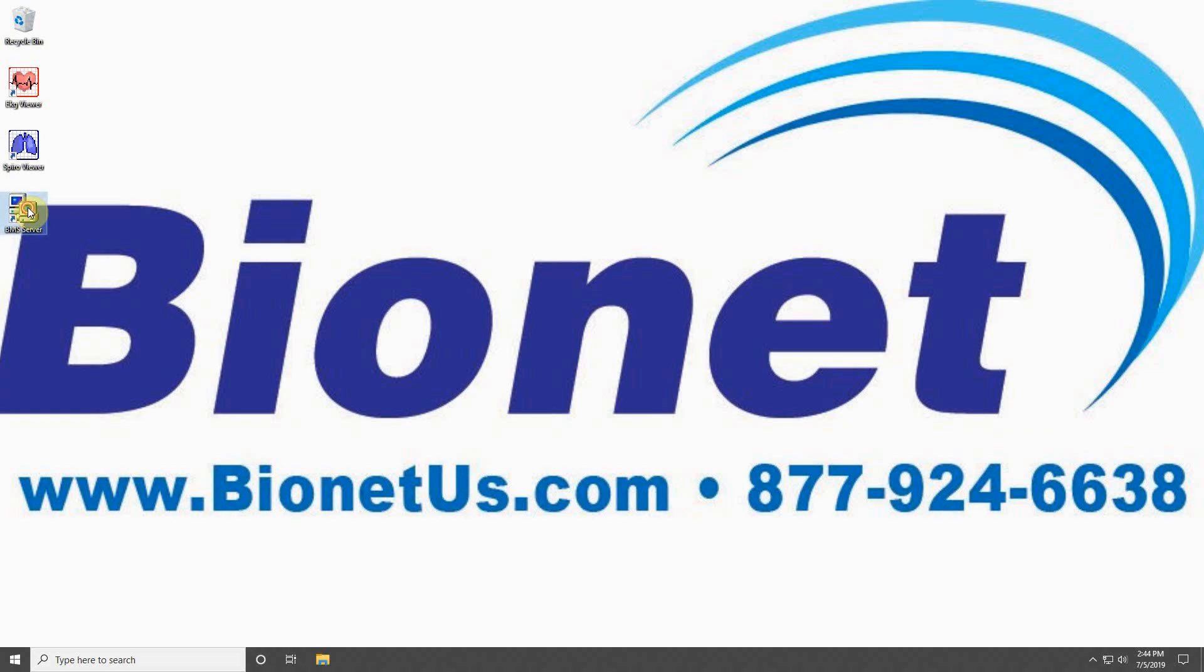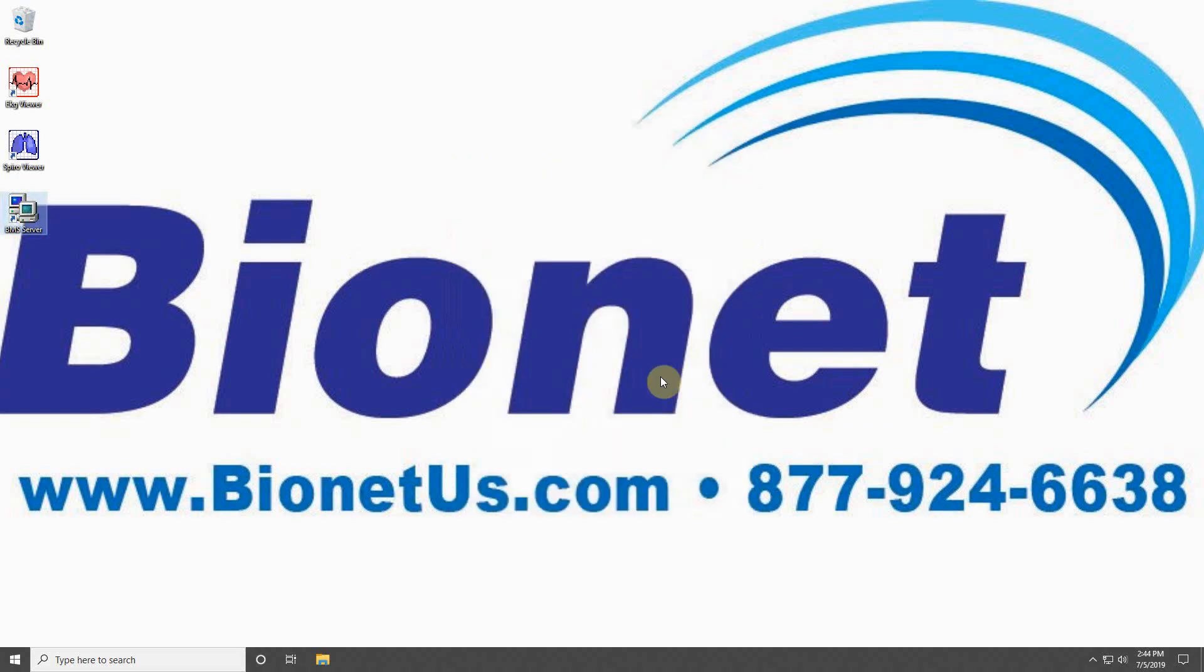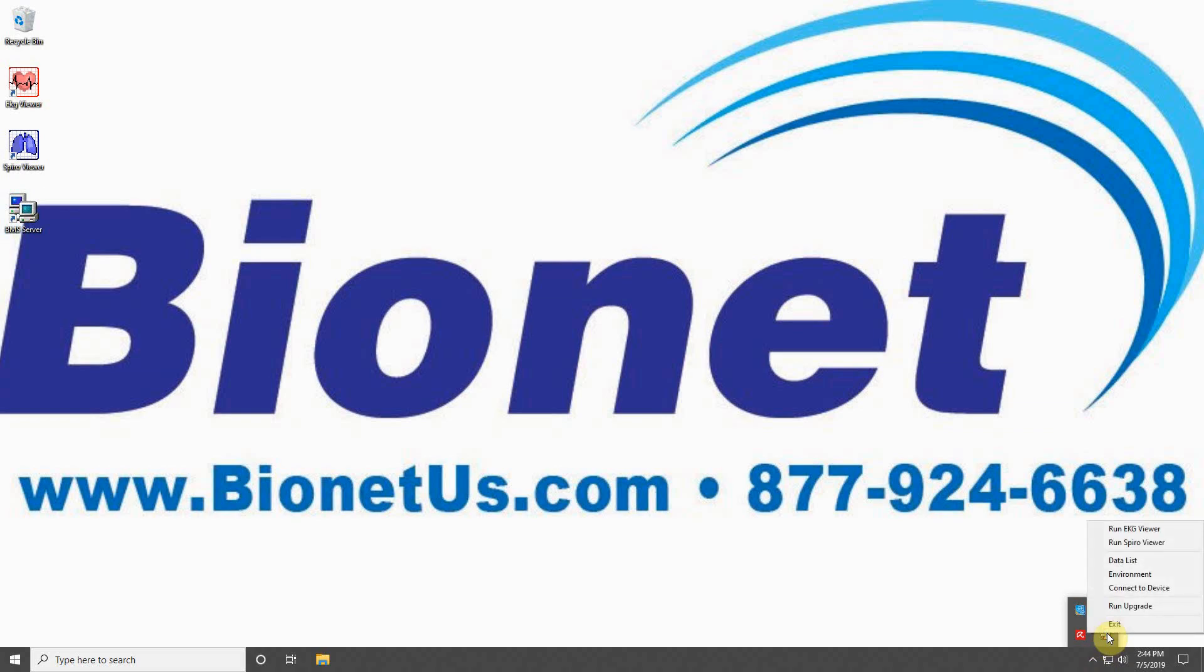Double-click the icon to start the program and open your system tray to find the BMS Server icon. Clicking on this icon will bring up a list of options for the program. Let's start with Environment.